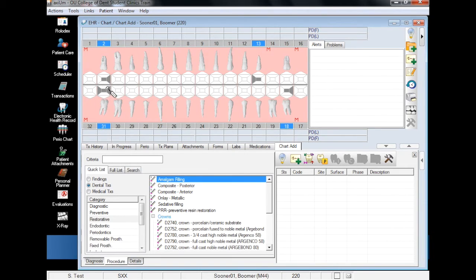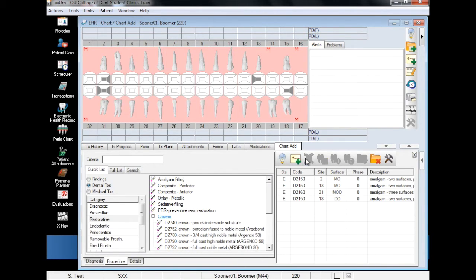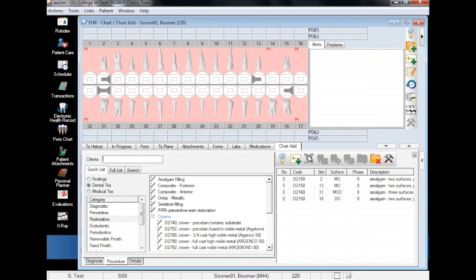Once you have charted all of the Amalgam Fillings, click on the Add Finding icon and all of your findings will appear in the list with the appropriate code, site, and surface.